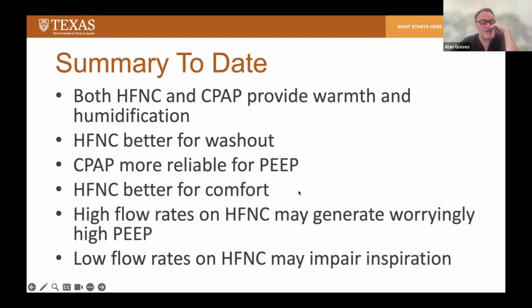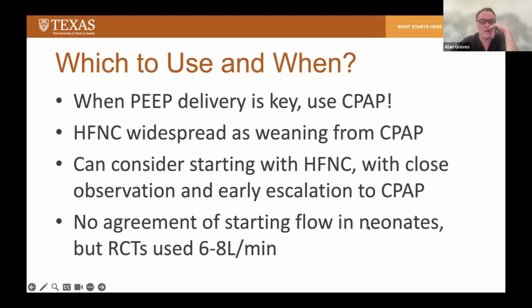Low flow rates, anything less than 1 liter per kilo, may really just be getting in the way of inspiration. And I would encourage you to think carefully about ever leaving a baby on less than 1 liter per kilo through a set of high flow prongs, especially if those prongs are mostly filling the nose. So then our which to use and when becomes really straightforward. If you really want to give a baby PEEP, then you should use CPAP.